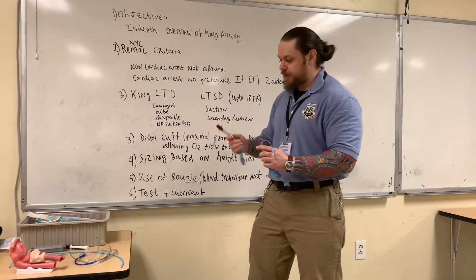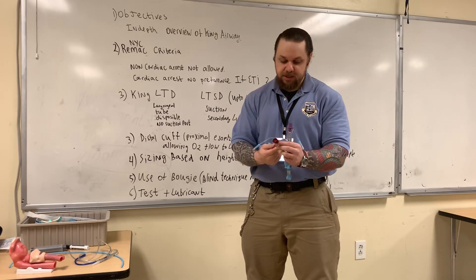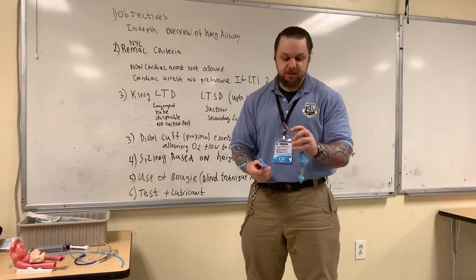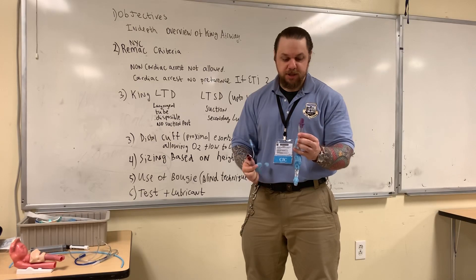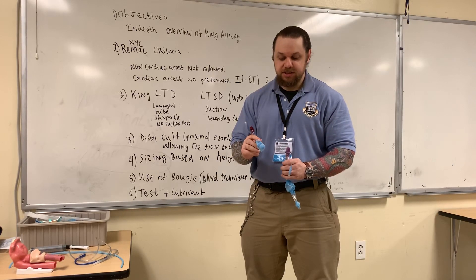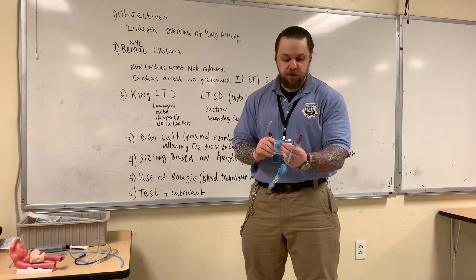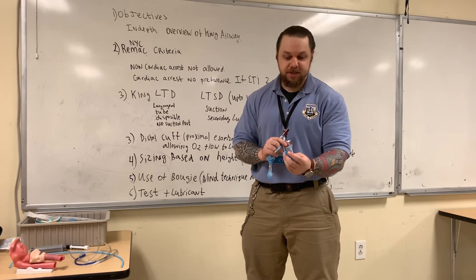I'm holding both varieties in my hand. In my right hand I have the King LTD — there's no suction port here — and here I have the LTSD with the suction port shown here. The LTD without the suction port has no opening that will go inside the gastric room, whereas the LTSD has an opening to accommodate the gastric tube to go to the stomach.